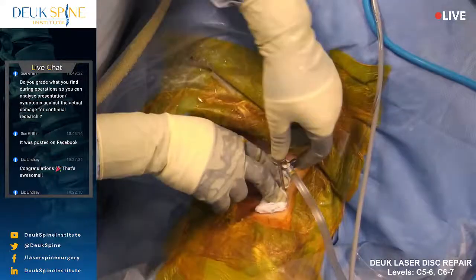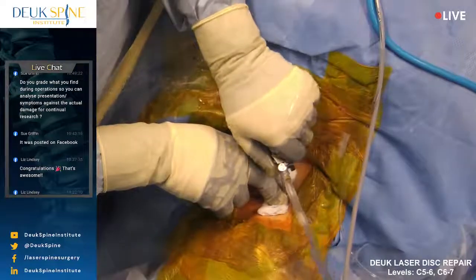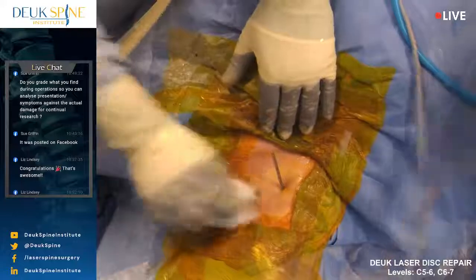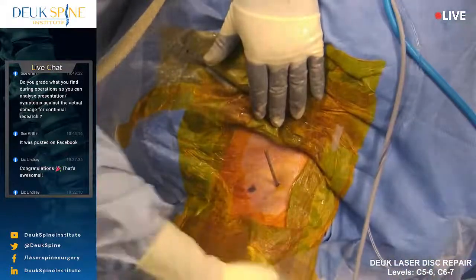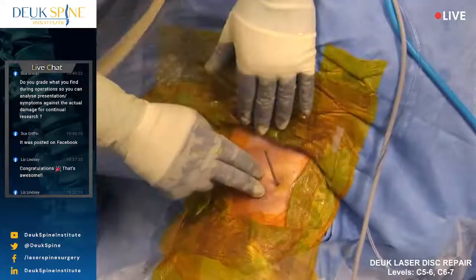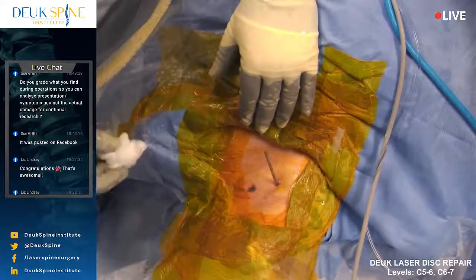Let me just show you guys before I take this all the way out what we did here. But I just don't have time to do it. But we do have obviously all the video. So, all right, chin is here, face is here, tube is coming out of the mouth. The patient's asleep. We're waking him up. This is the chest, left side of the neck. We had 0 blood loss for the surgery, no blood loss.